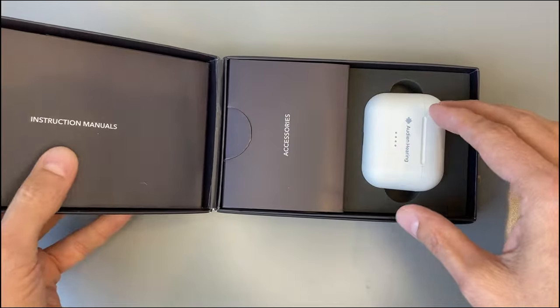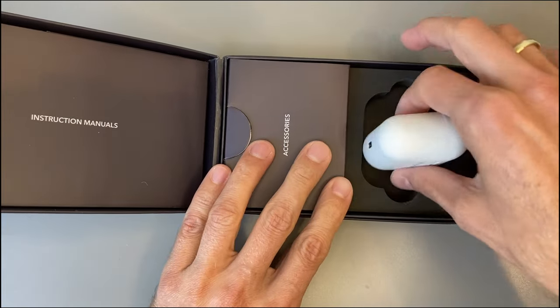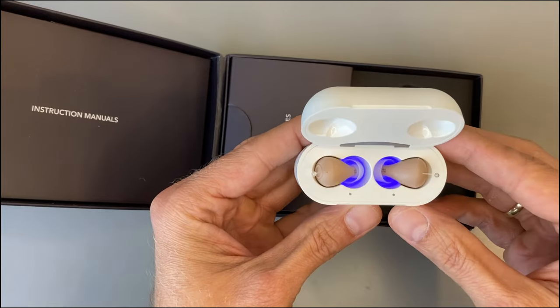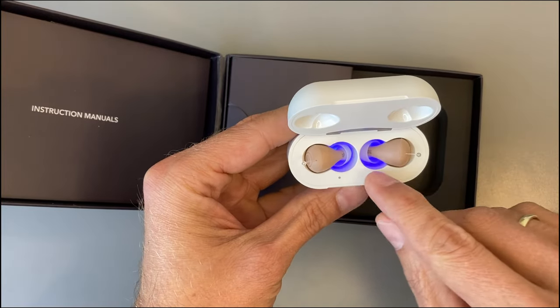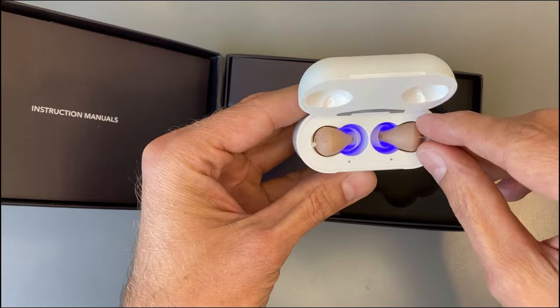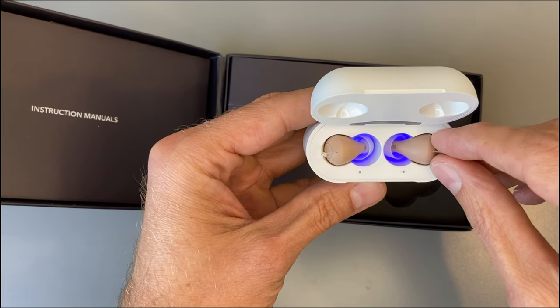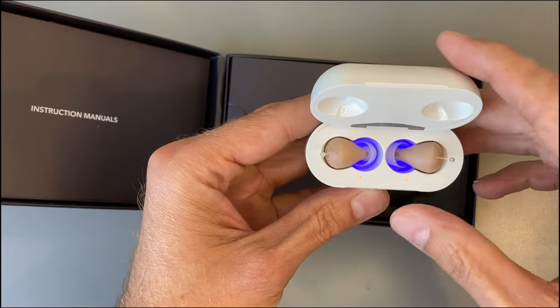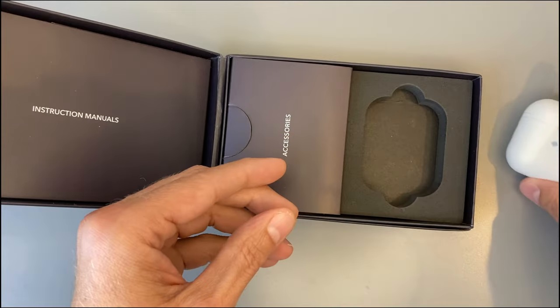Here is the charger — a nice small charger. The hearing aids are inside and you can see this blue light, which is a nice design detail.